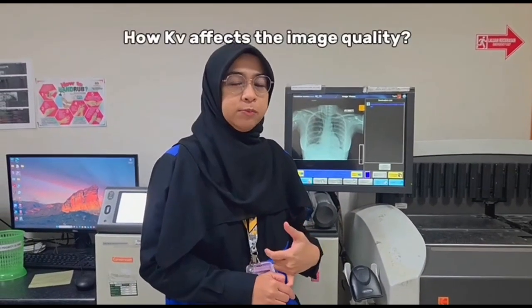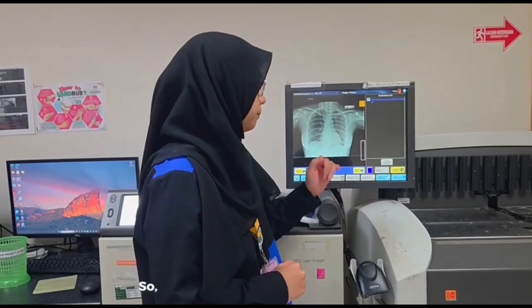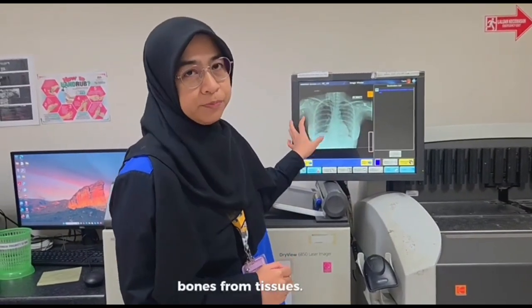Then, how does KV affect the image quality? High KV means more penetration with lower contrast. So, the tissues will look similar. While lower KV means less penetration with higher contrast. It is better for distinguishing between different tissues.